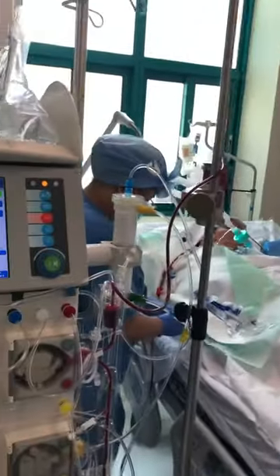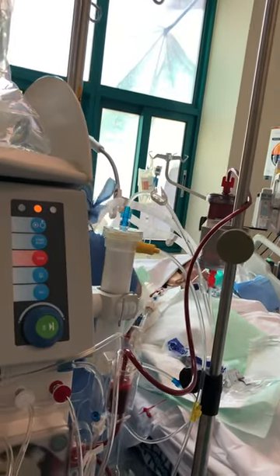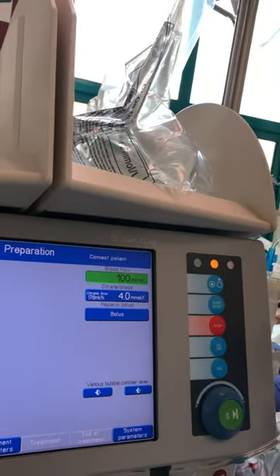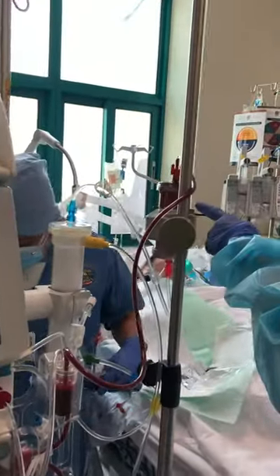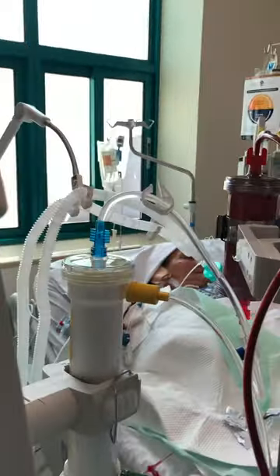Disconnect this one because suddenly there's a flat. We will remove and change it. You can still use this one as long as it's within 24 hours. If you have clotting and find a chance to remove it, you can remove it again — you have to clamp it. What if the clot is here also? No, it will not stop because all beads are independent, so if you find some small clots, no need to worry.